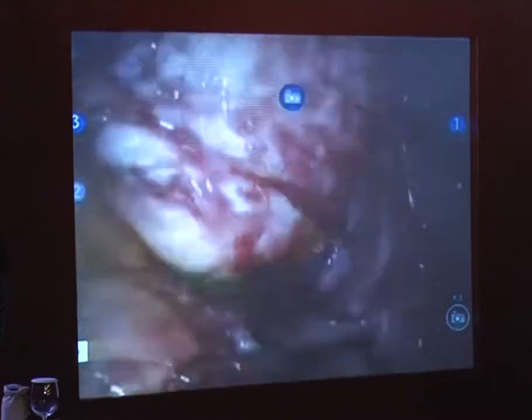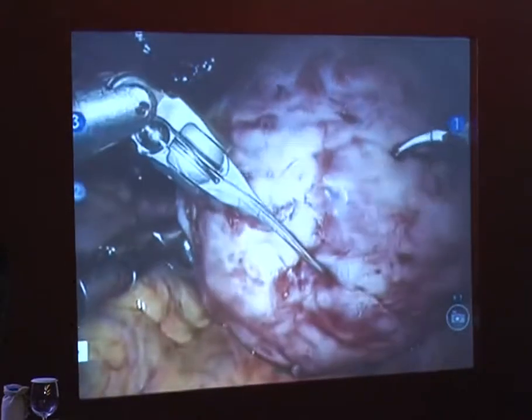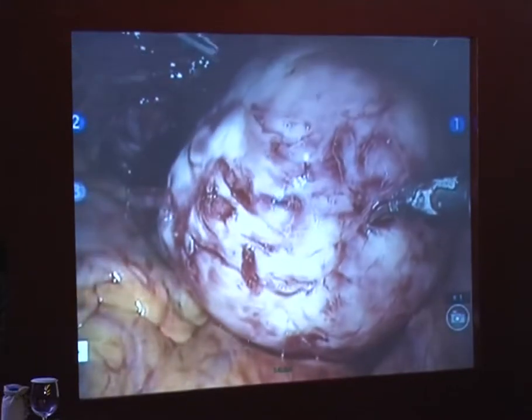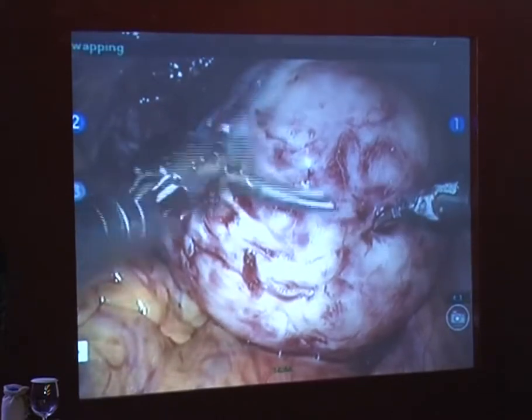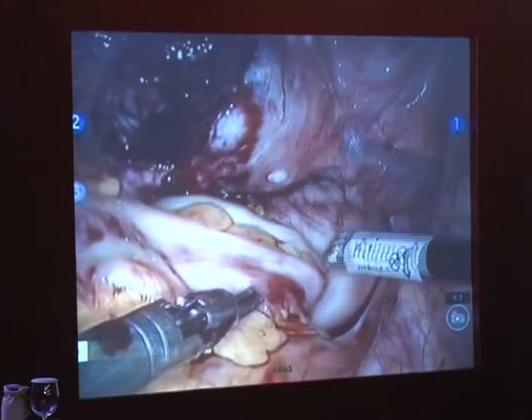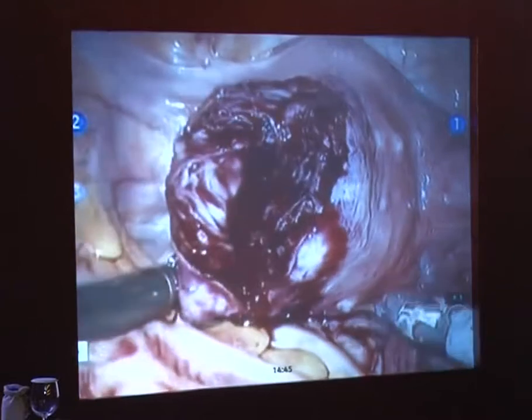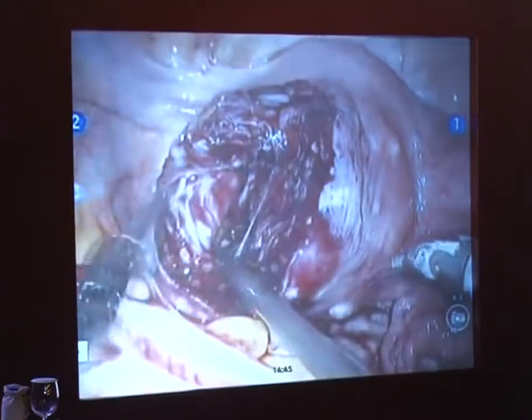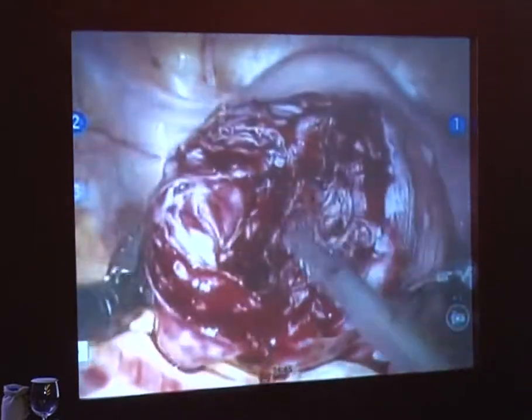And as you can see, efficiency-wise, I've got my suture already, so I'm ready to roll. I'm going to take one of them with me here. This is one right here. So I'm good to go. And the second one is back here. So no need to bring needles in. This is all going to stop oozing.